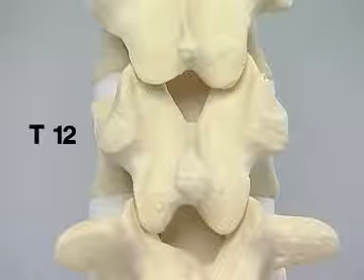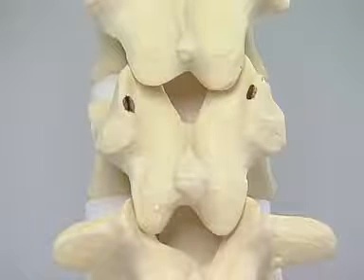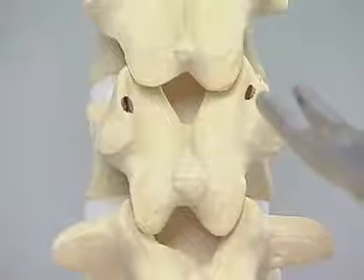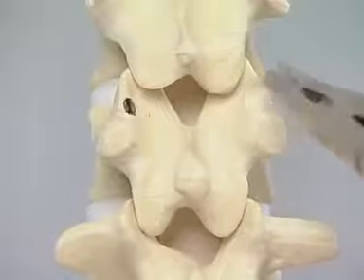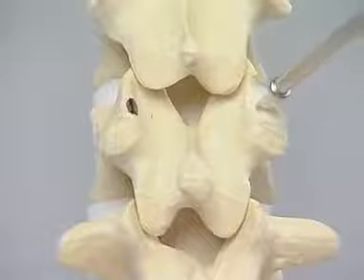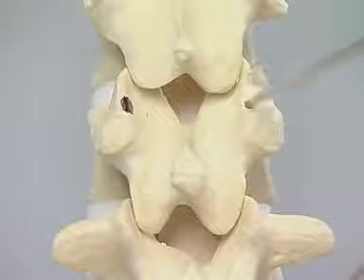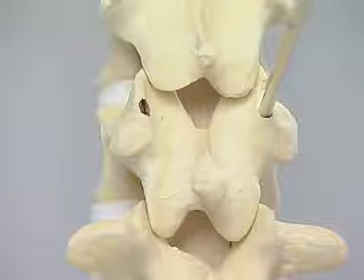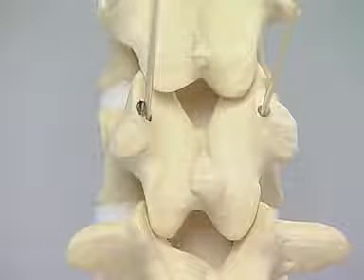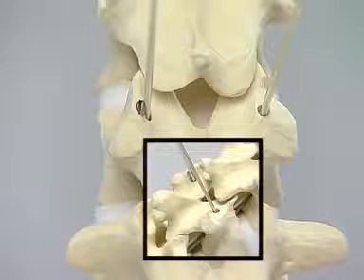T12 has some atypical anatomical features, and these vary from model to model. The entry points can be marked as for the other thoracic vertebrae, but removal of the short stubby transverse process at T12 with the rongeur opens the cortex for the ideal entry point. This can then be opened with the pedicle awl and pedicle probe. The K-wires can be inserted, and the medial angulation can be seen, with caudal angulation of these wires at T12.